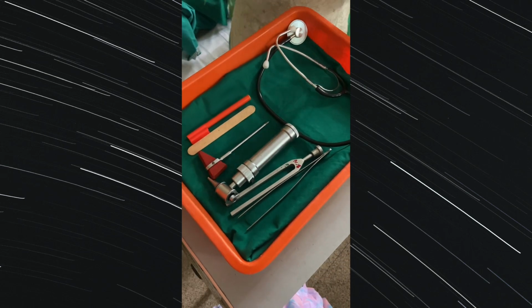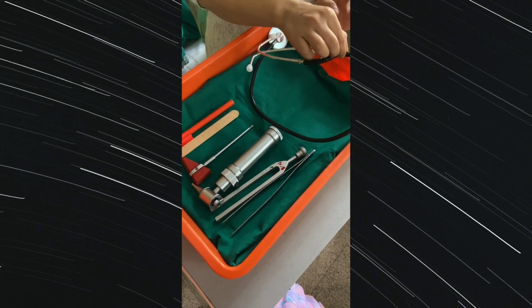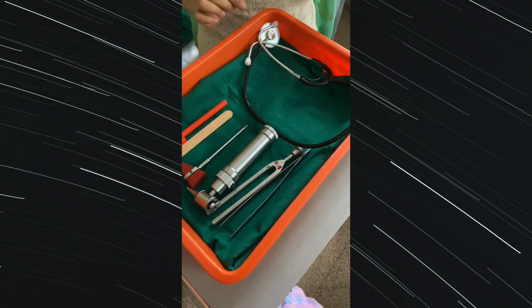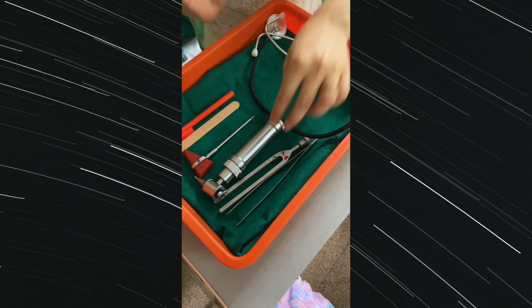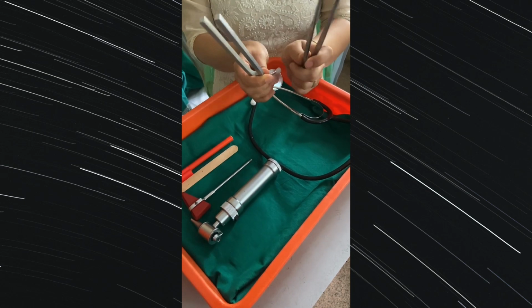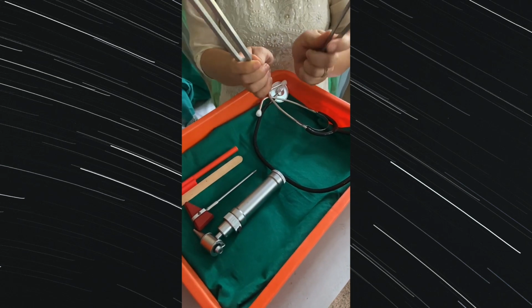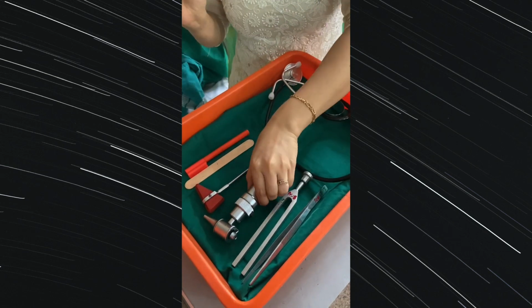In this assessment of head to neck, we are going to use the stethoscope. As you all know, we have to palpate and hear the bruits in your carotid artery. For that we require, and we have taken, two types of tuning forks. These are for your ear assessment. When we do the ear assessment, we have to vibrate those and perform it on the patient.